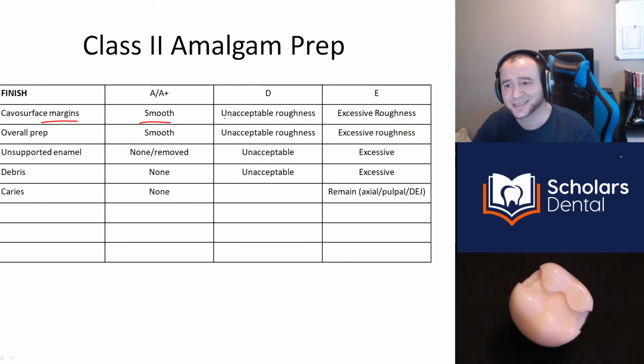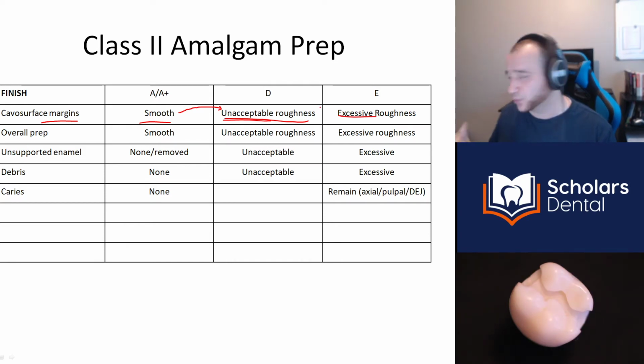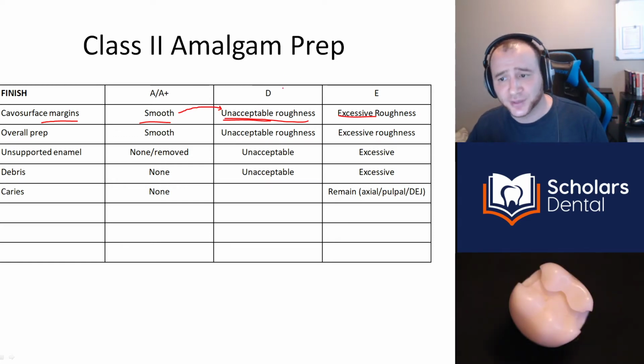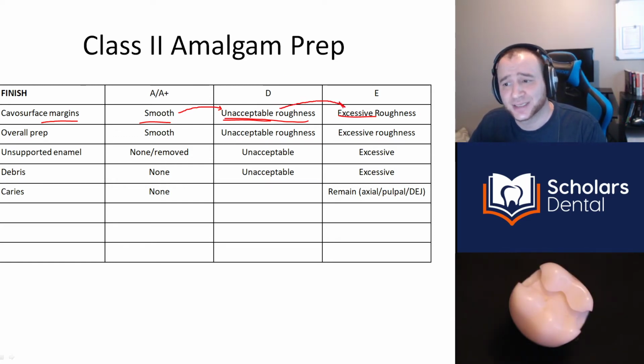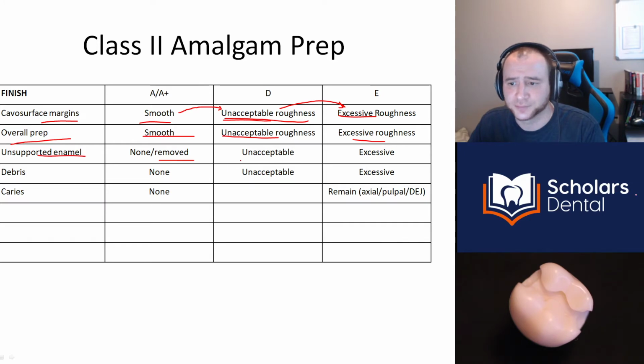Now look at this, unacceptable roughness. That's the issue. That's subjective. So you might have some roughness, but who says if it's unacceptable or excessive? That's why you want to try to do this right. You want to get the best smoothness, because if you have unacceptable roughness, someone may consider it excessive. It's subjective. Then you have an overall prep. You want it to be smooth. Again, unacceptable roughness or excessive. It's subjective, not an objective measure. Unsupported enamel, you need to make sure you removed it. If you didn't, again, you have that same subjective problem.